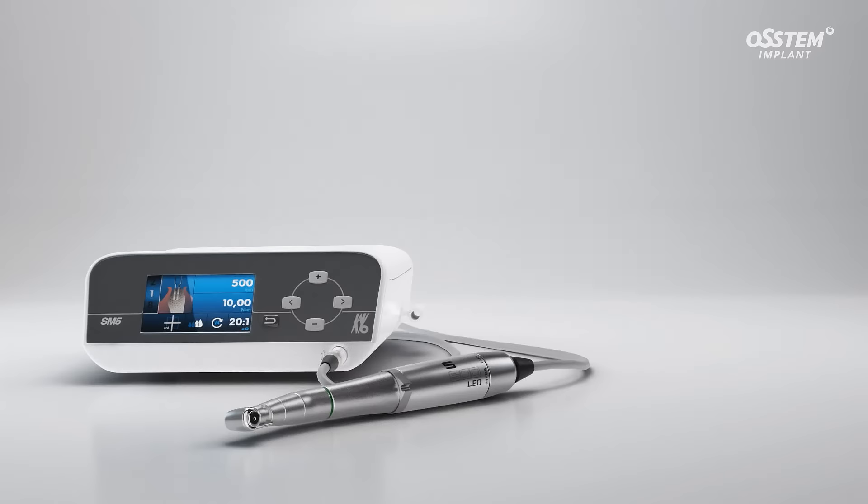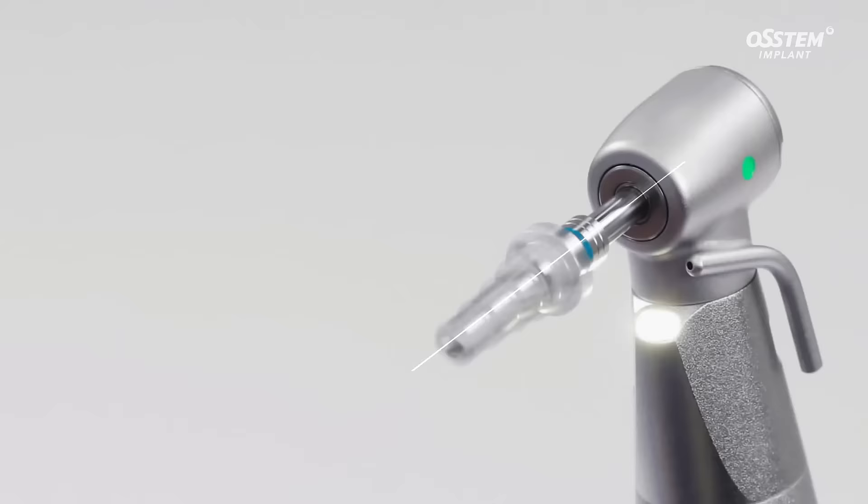Introducing the SM5, the dental implant surgery engine that provides safe surgery with its accurate torque value and drilling ability.